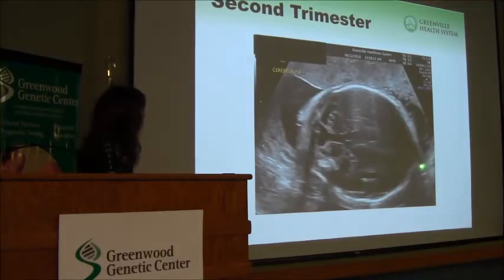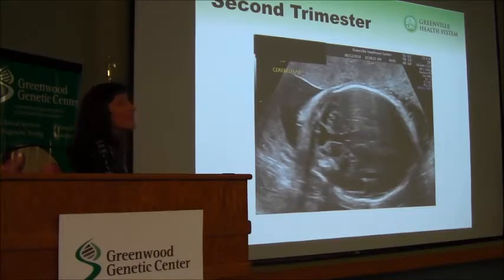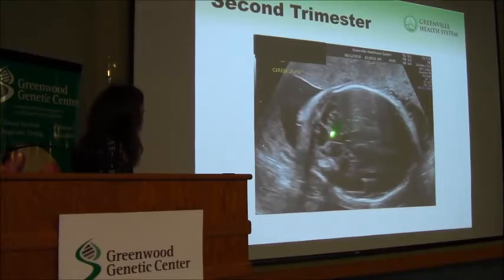All right, front part of the head, back part of the head. What's the defect? Dandy-Walker. Dr. Rogers has seen a lot of this. You shouldn't be answering. So this is a splaying of the cerebellar hemisphere here, and there's a defect here in the vermis.